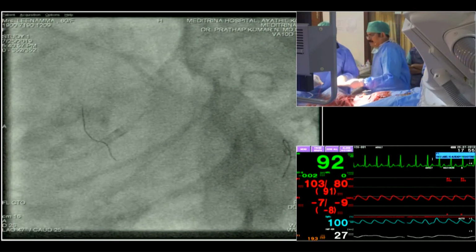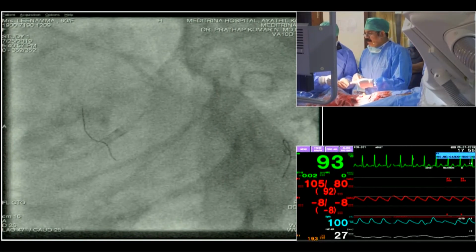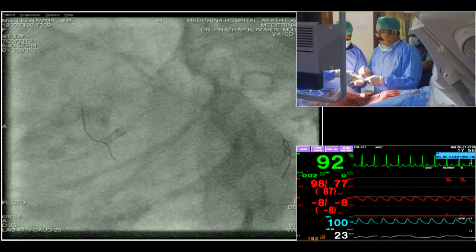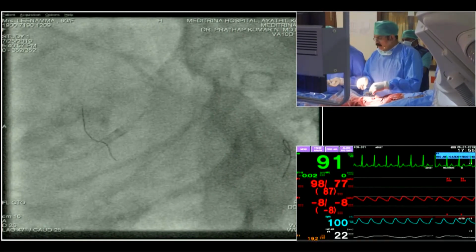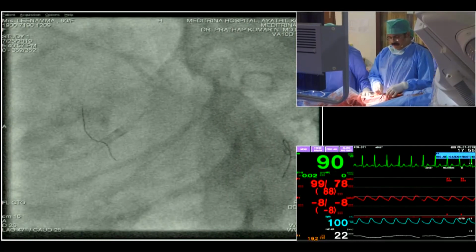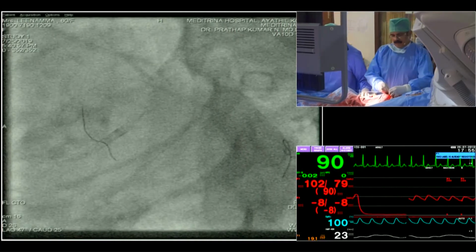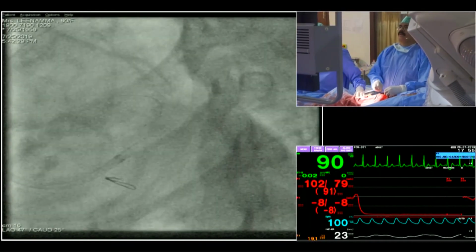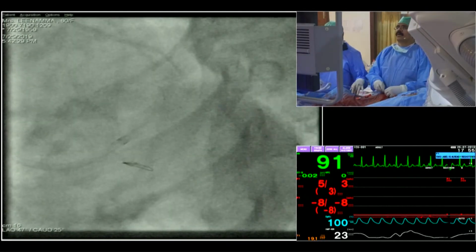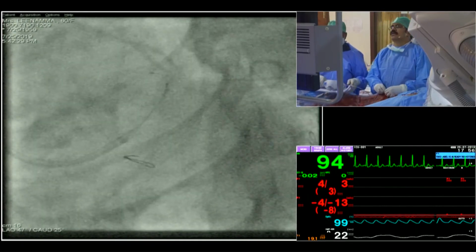I mean, the rest of this is sort of cleanup and routine strategy at this point. So the IVUS, seeing the stent size and strategy, is the more important question. Mukesh, anything you want to say? Fix the wire. Whatever you're comfortable with, that should be done first. Then when you fail in that, all the other things come.